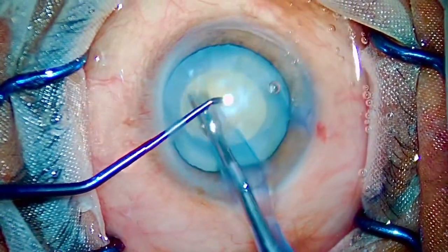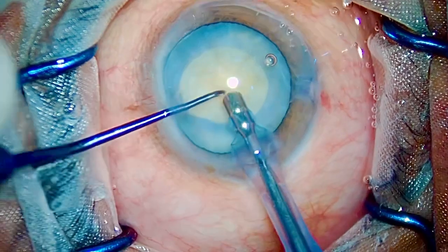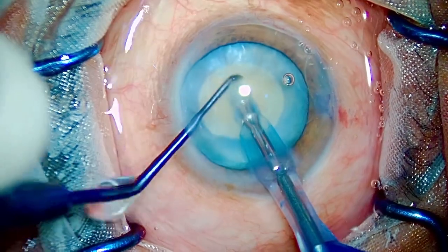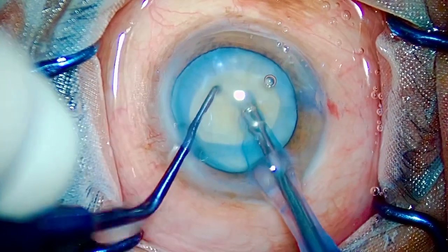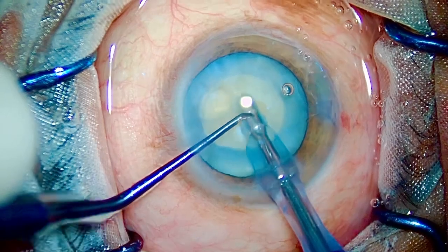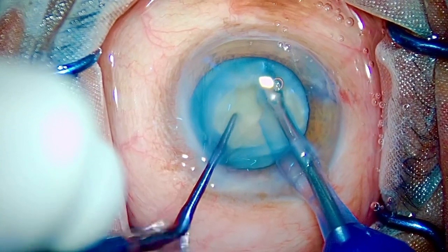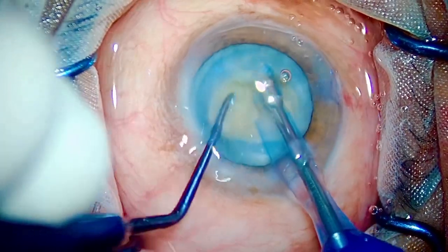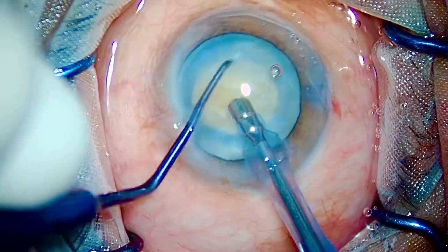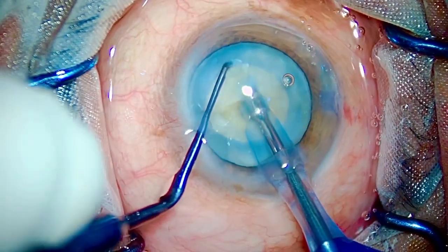Tip number two: you have to aspirate the cortex first with the FACO to decompress the bag. I am aspirating and going with FACO pedal position three, holding the nucleus with the belly. I have not yet reached sufficient depth in the nucleus — FACO position three, going inside, FACO position two and chop. The nucleus is hard but I won't give up. FACO position three, FACO position two and chop.